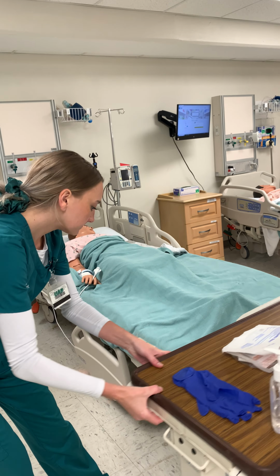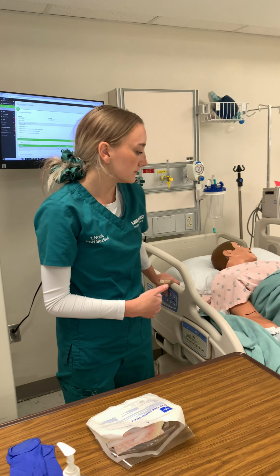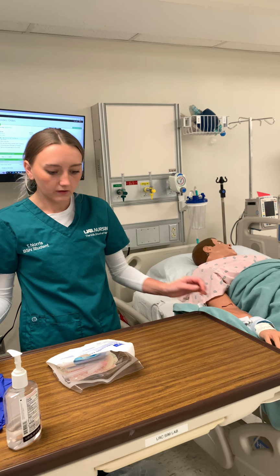I'm just going to go ahead and remove my badge. Okay, I'm just going to go ahead and close the curtain at this time if my client had one, and just raise the bed and my table to a working height. And open my sterile package to remove my mask. All right, and I'm going to apply a pair of clean gloves just to remove the previous dressing.